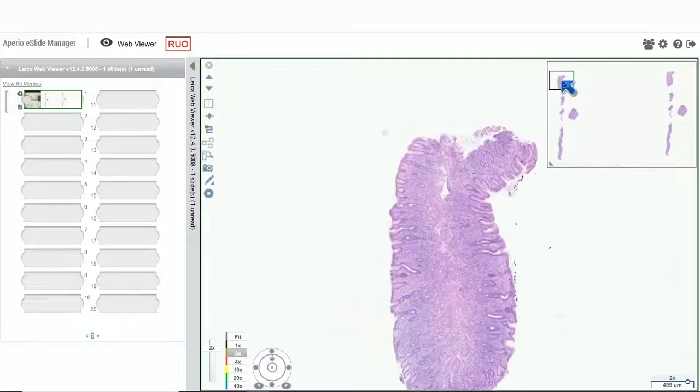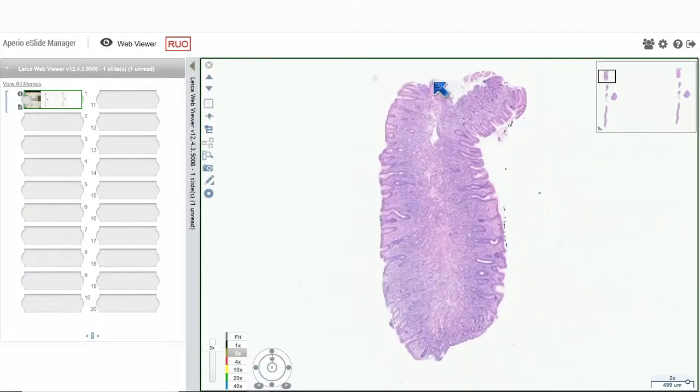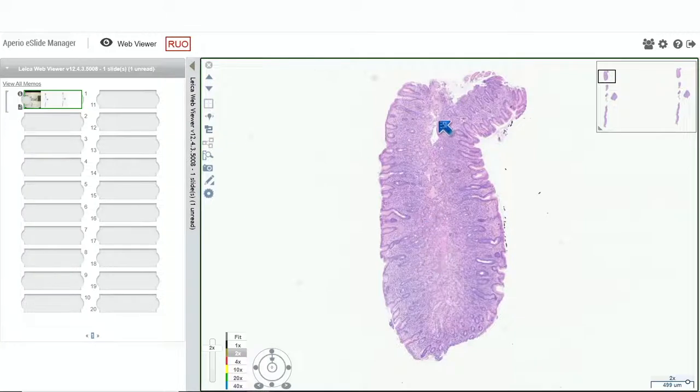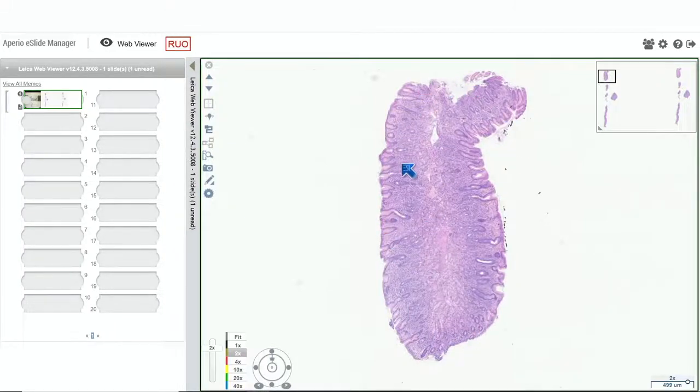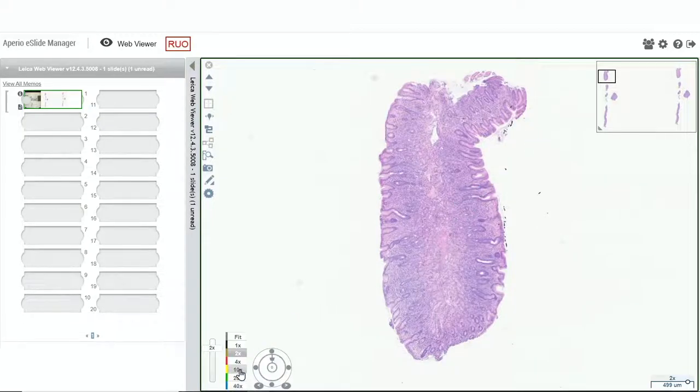If we go around to different pieces, we can see in this one, for example, even though it's embedded so there's epithelium on both sides, we can appreciate that the mucosa is diffusely expanded by a chronic inflammatory cell infiltrate.